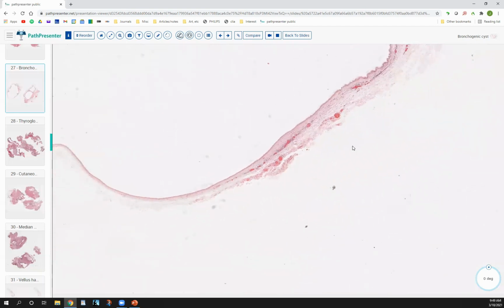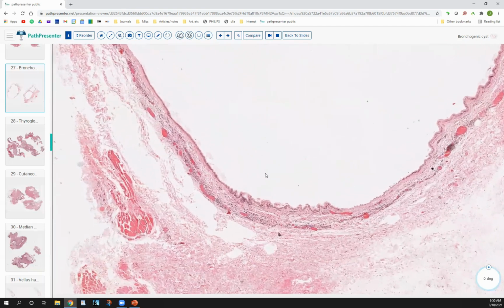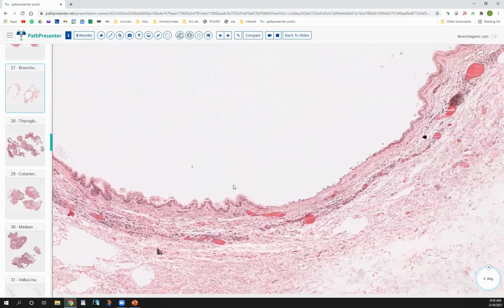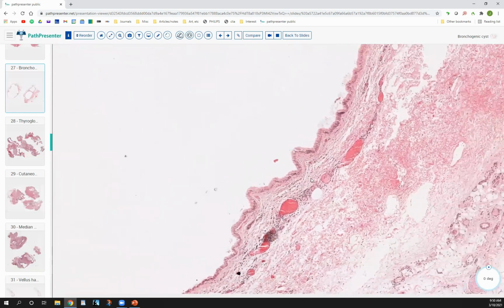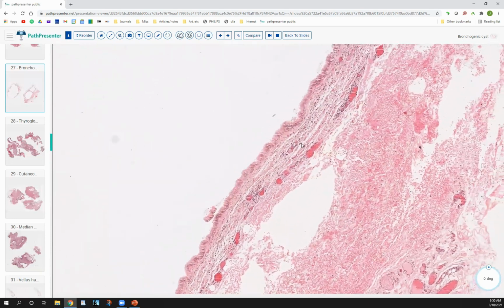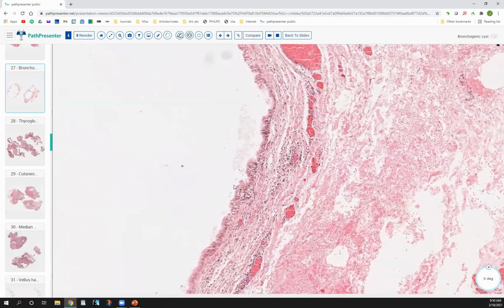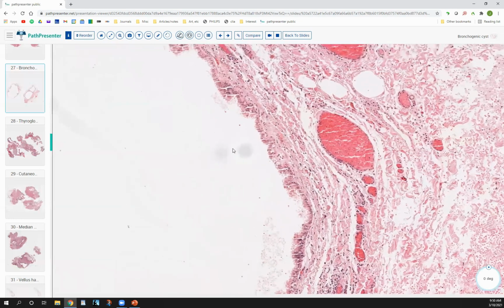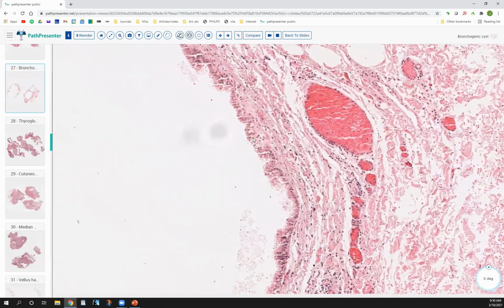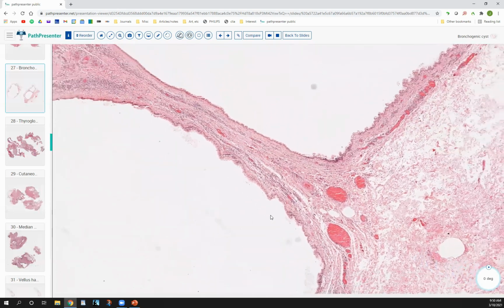So that's the other thing. And a lot of it is anatomic location, because if you see it at the sternal notch, often you're just kind of primed. Even without seeing any of the histology, if you hear a cyst at the sternal notch, you're starting to think, well, could this be a bronchogenic cyst? So this is a good example of that. Here's maybe a few of these goblet cells right in here, actually. Not as many as I would like to see, but they're there, I think.